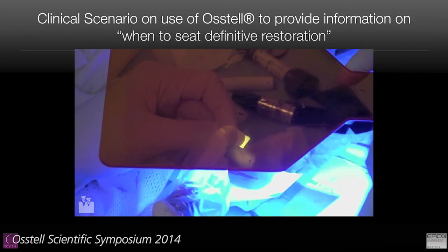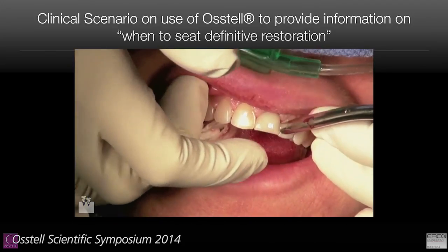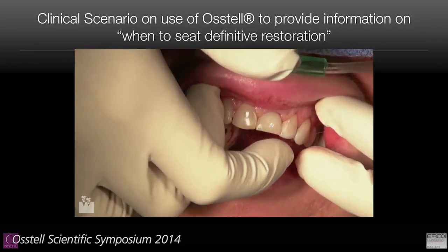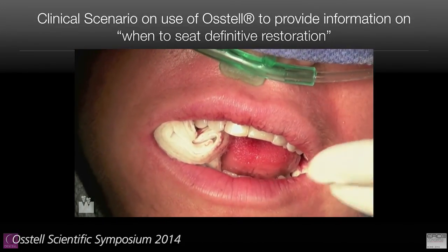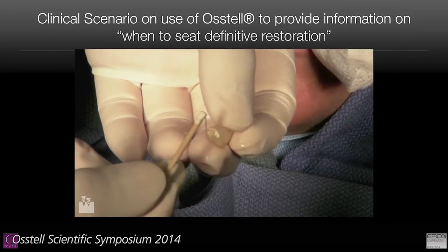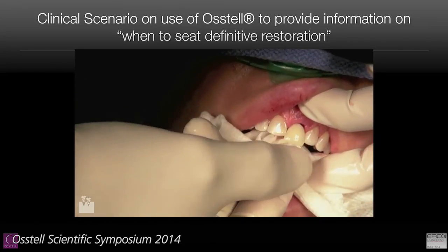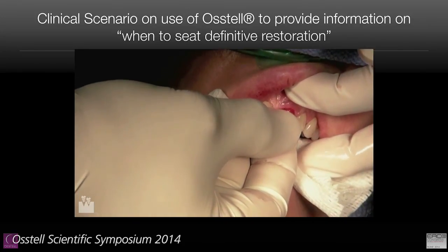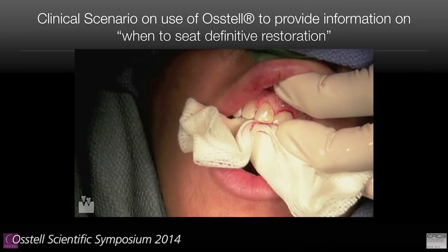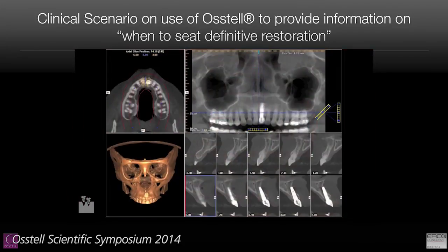This concept really helps us to deliver the one abutment, one time principle, where we can deliver the definitive prosthesis, allow our soft tissues to mold around the abutment, and allow us to provide the patient with adequate soft tissue contours. And so you see here we're cementing the provisional restoration in place, taking care to avoid excess cement.